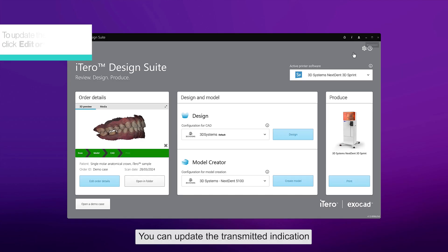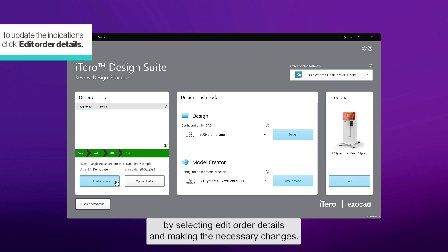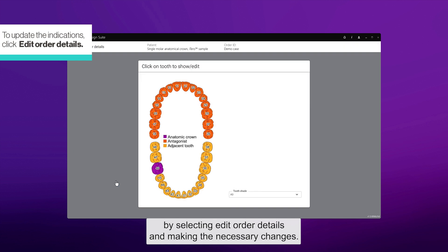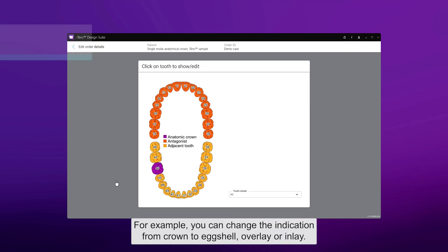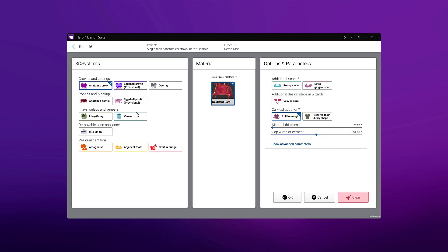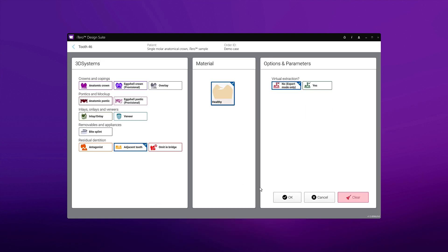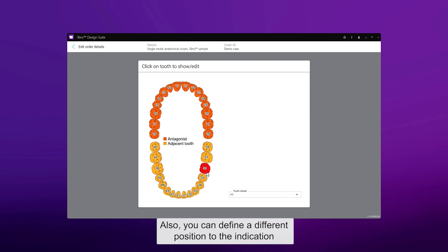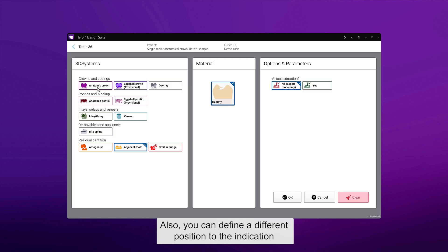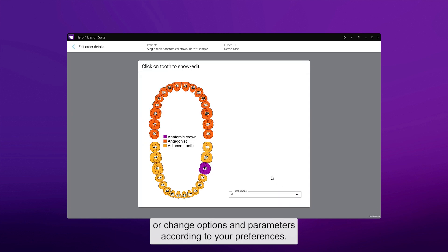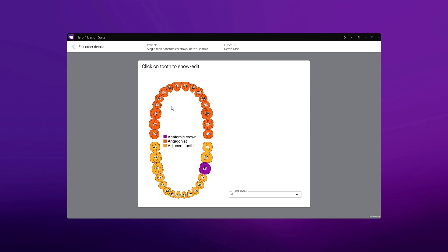You can update a transmitted indication by selecting Edit Order Details and making the necessary changes. For example, you can change the indication from crown to eggshell, overlay, or inlay. Also, you can define a different position for the indication or change options and parameters according to your preferences.